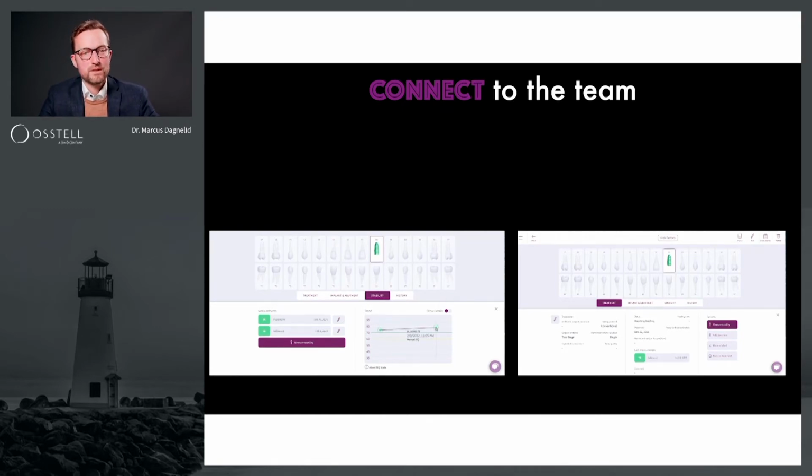And we see that there's an increase in ISQ. And I feel comfortable now as a specialist if I'm going to refer back the patient to the restorative doctor, they can go on with the prosthetic process and feel comfortable enough.